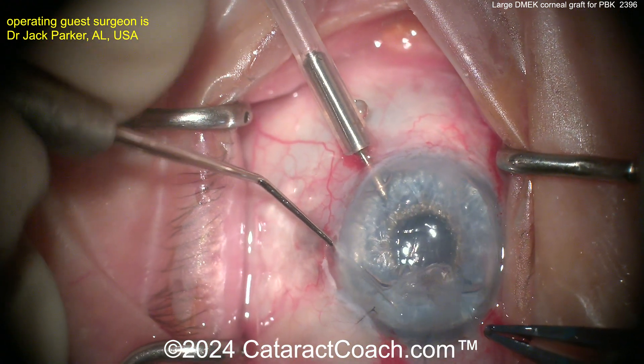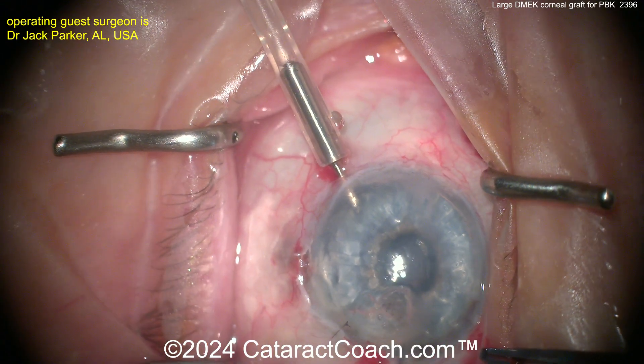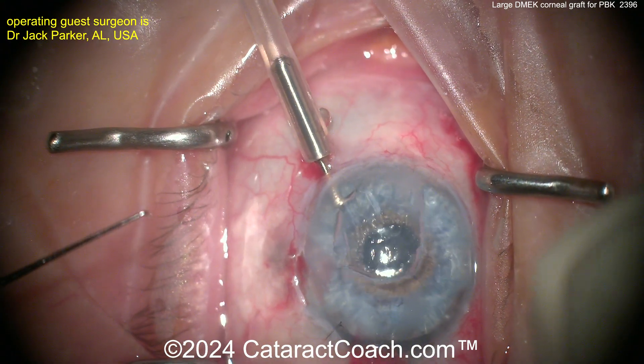Going back to this case here, carefully removing all of the existing Descemet's membrane from the patient, and now preparing a large DMEK graft. The big grafts are a lot harder to do.